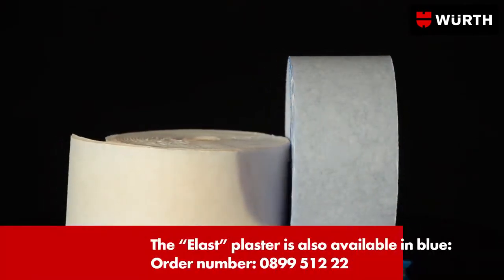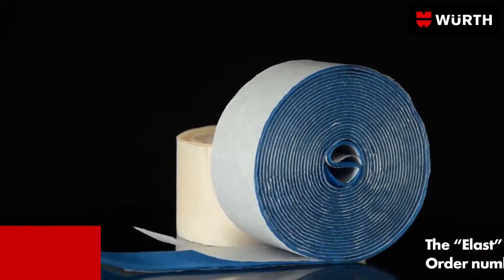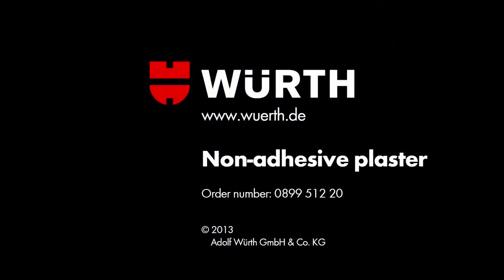Würth Elast non-adhesive plaster should always be ready to hand. Würth Elast non-adhesive plaster.